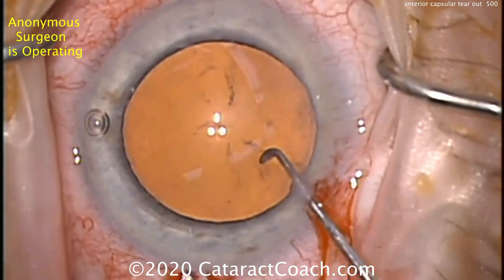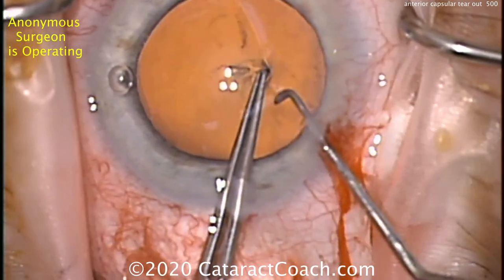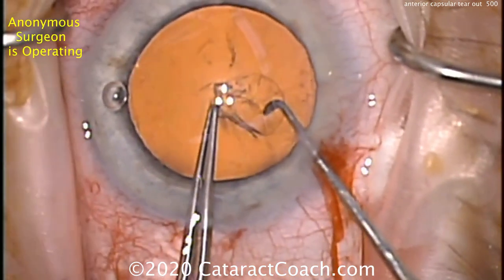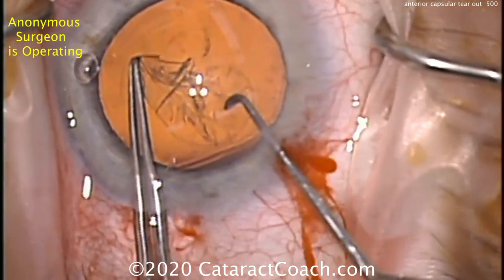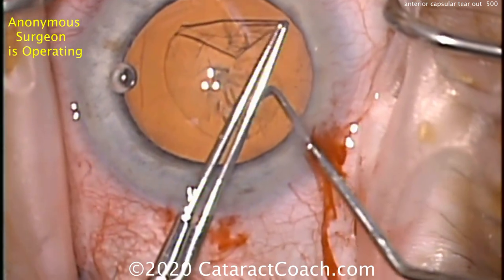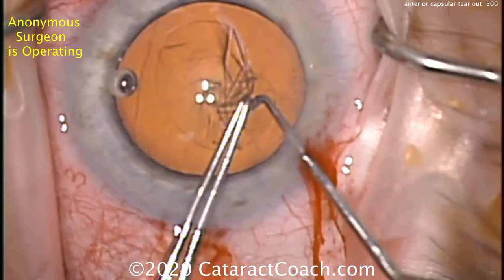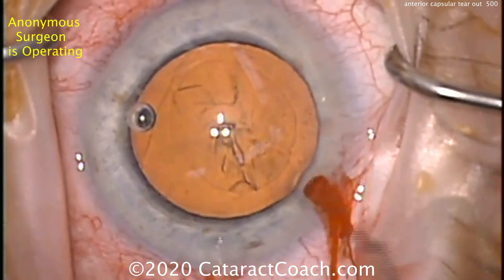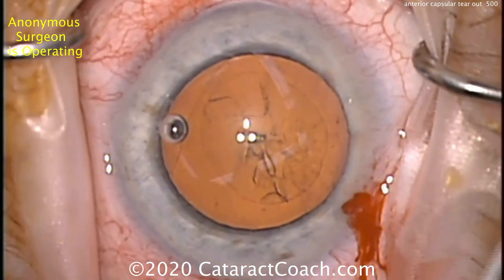We have an anonymous surgeon who's operating — a very advanced surgeon who's done more than 10,000 surgeries. Starting the capsulorhexis with just forceps, this looks like a left-handed surgeon using the right hand to fixate the eye via their paracentesis. The capsulorhexis looks fine — we don't have any radialization here. It looks normal; the CCC is completed. And you saw the intro picture, so you know it's going to be radialized.